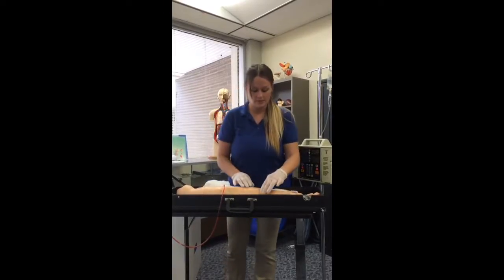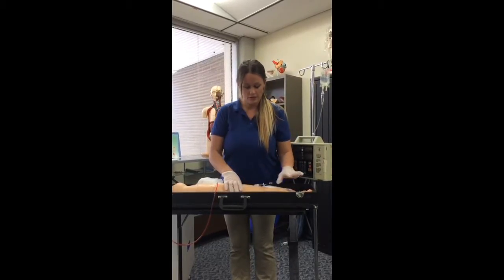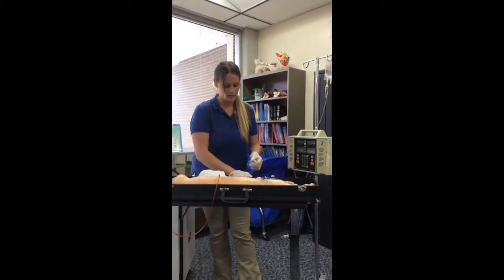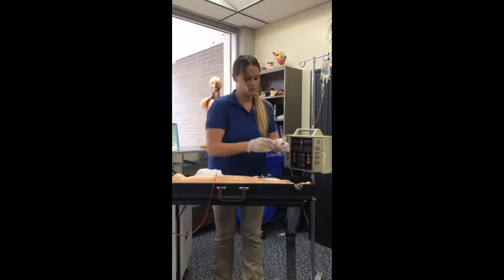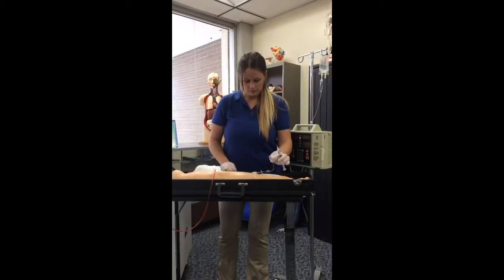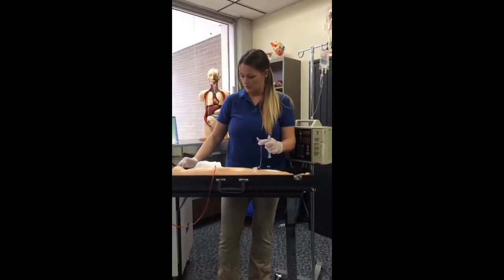Then I'm going to inspect the IV site for any redness, swelling, edema, pain, infiltration. Once I've seen that everything's okay, I am going to take my saline and wipe with alcohol. And I'm going to unclamp, remove the needleless, and put it in the sharps container.